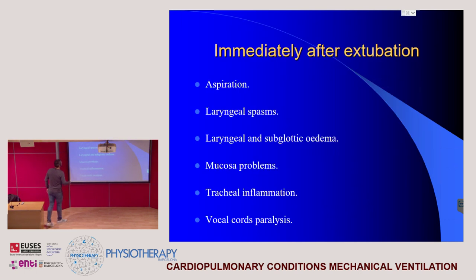But that is not the only problem, because during the extubation there are also problems that could appear. Probably the most typical one is aspiration, because if we remove the tube and secretions remain above the cuff, those secretions or even other material could go down inside the lungs and provoke an infection.